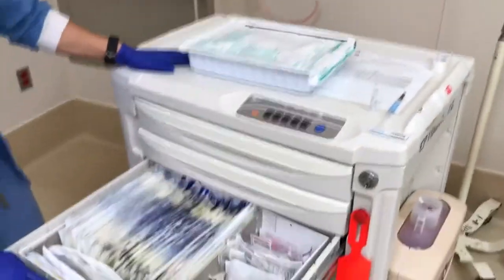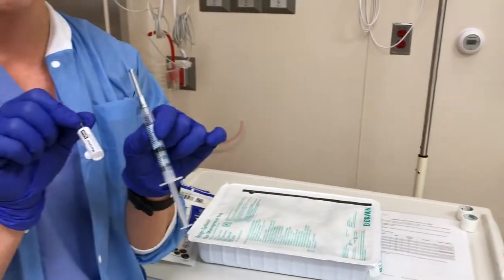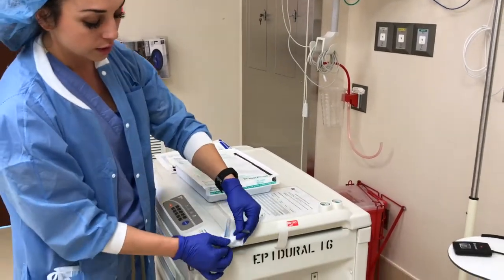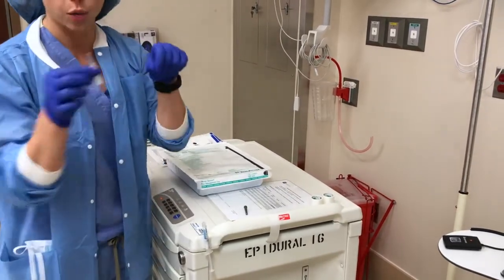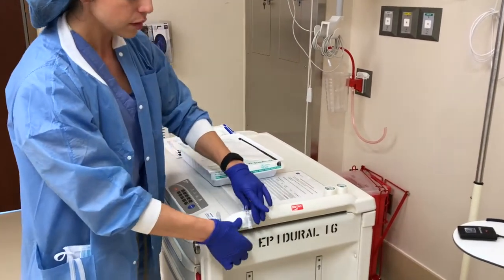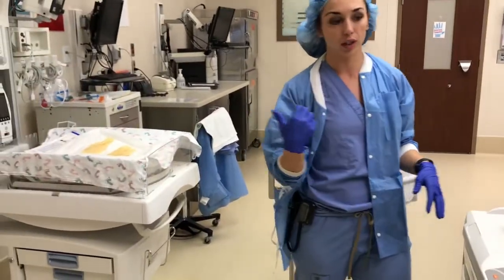And then the gloves are obviously in this next drawer up. And then we have our fentanyl and our bupivacaine. What I do is just tape these to the cart as you open them, to the side of the cart. Obviously I'm not going to waste this, so you'd open it and then tape that to the side of the cart as well, so that you have access to both of them. Make sure you grab a trash can and have a location that you can put your open gloves.